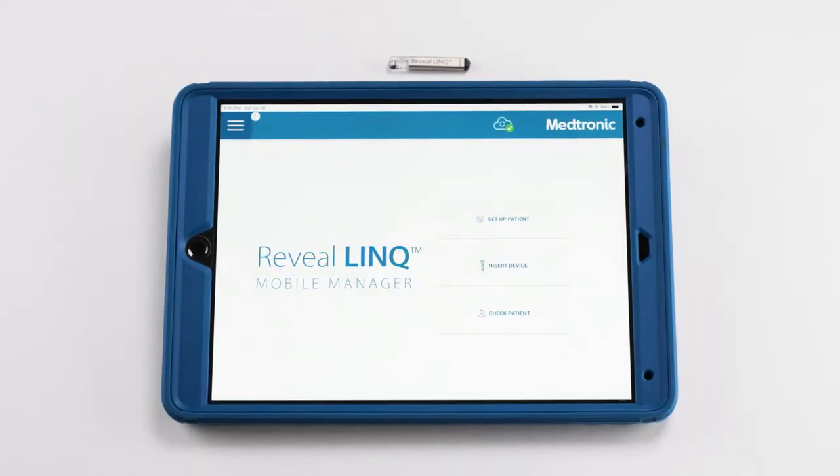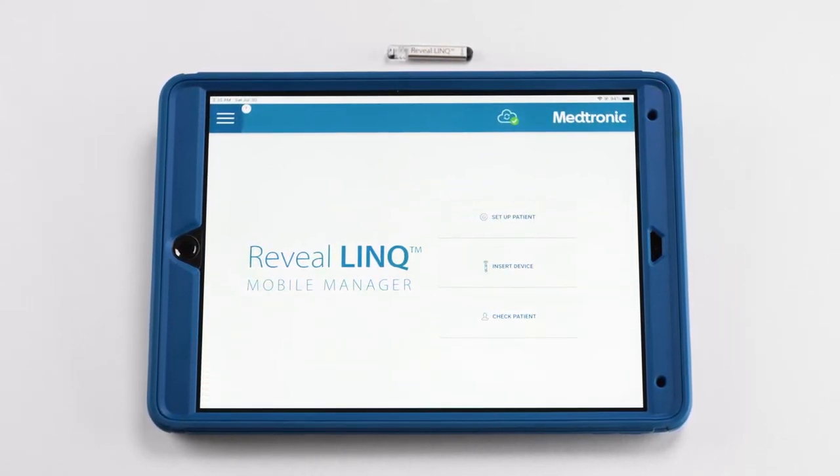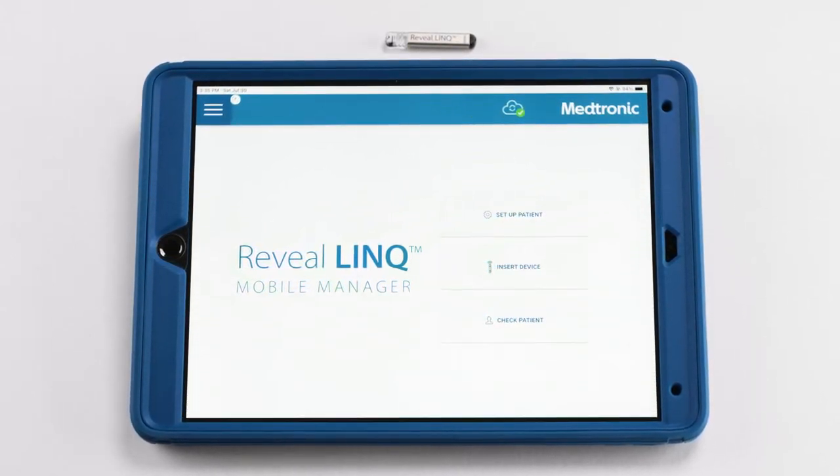To optimize workflow of a RevealLink ICM insertion, you can set up the patient's demographics up to seven days prior to the implant date. This ensures a smooth insertion and avoids intraoperative delays.